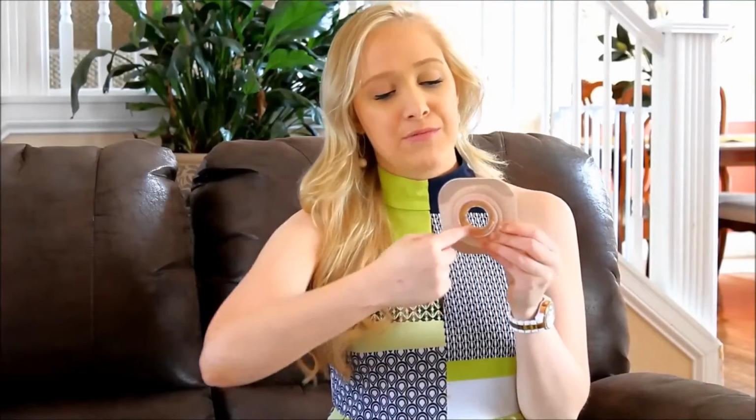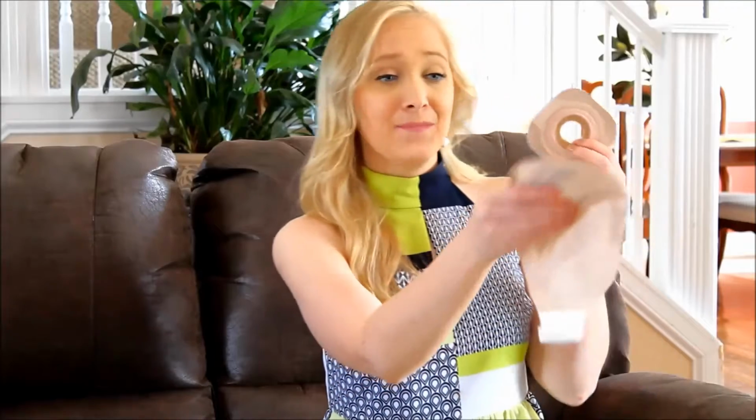So once I line the flange with the Adapt paste, I just stick it on there and put it around my stoma, and then I take my finger, I wear a latex glove when I do this, and I just put pressure around the lining right around the stoma area, because then that creates a secure seal. It's going to help that Adapt paste really mold to the area around your stoma and just give you a good seal and make sure that things don't leak later. So then once I do that, I just take my bag, snap it on there, and I'm good to go.